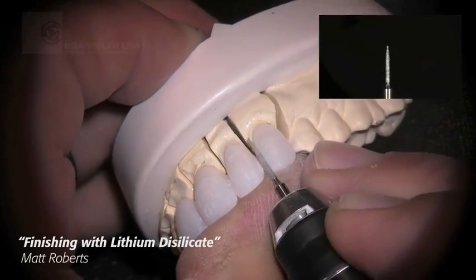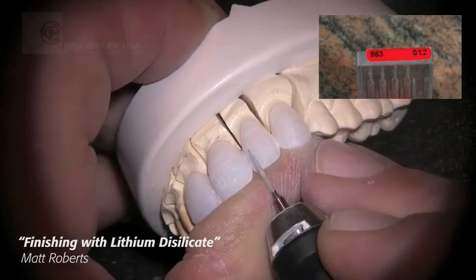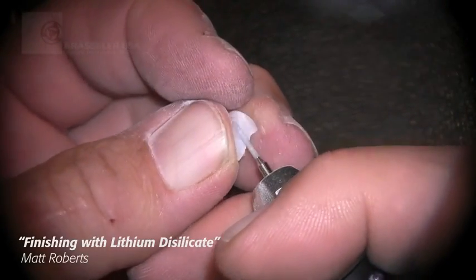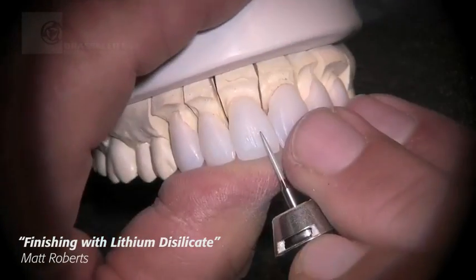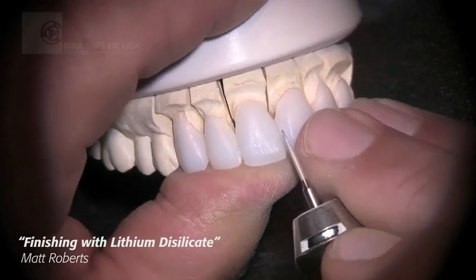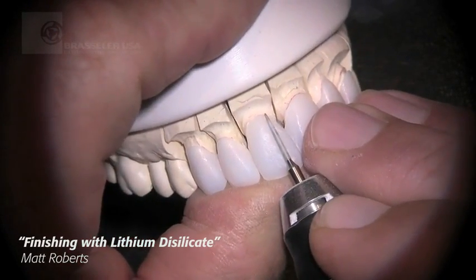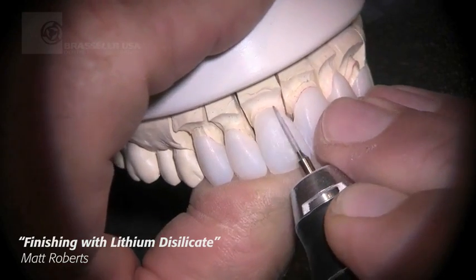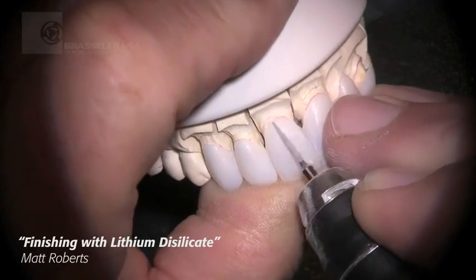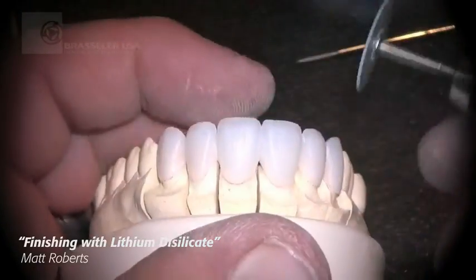I'll then move on to some of my favorite Brassler diamonds — the 863012 — that I use for all of my surface morphology. I may use some of the thin diamond discs in between restorations to open up embrasures. Here you see me putting in surface morphology again with the 863 bur, working on the emergence profile just a little bit.